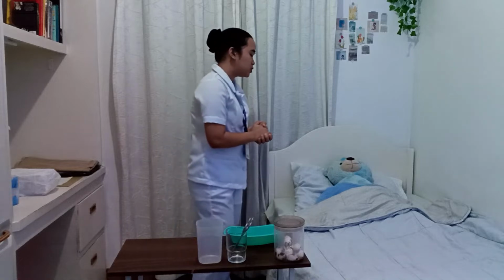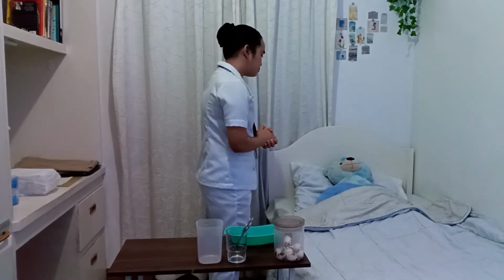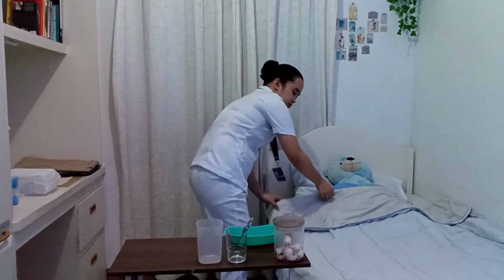Alright. So now, we're going to drape the patient using a bath blanket and expose only the areas to be used. So this is done to prevent the patient from getting embarrassed and of course from having chills, which may cause tension that may interfere with the easy insertion of the catheter. So now ma'am, I'm going to remove your top sheet and I'm going to drape you with a bath blanket, okay? Alright.